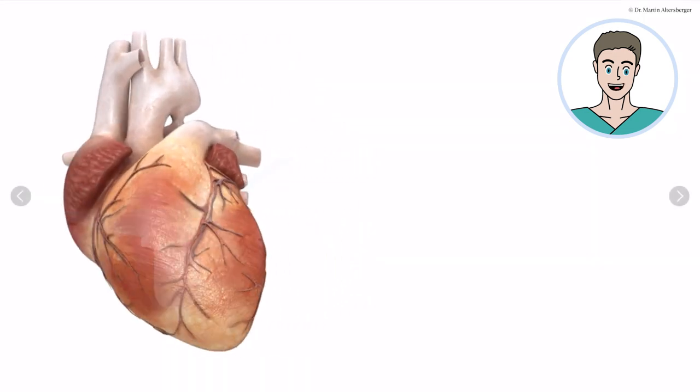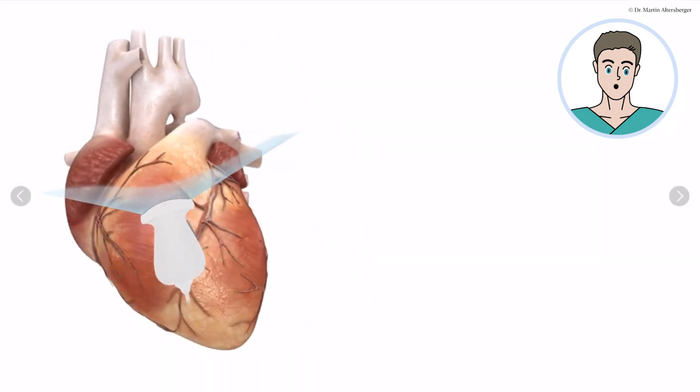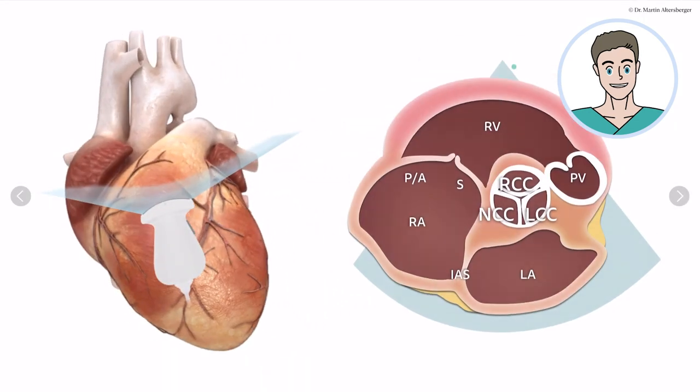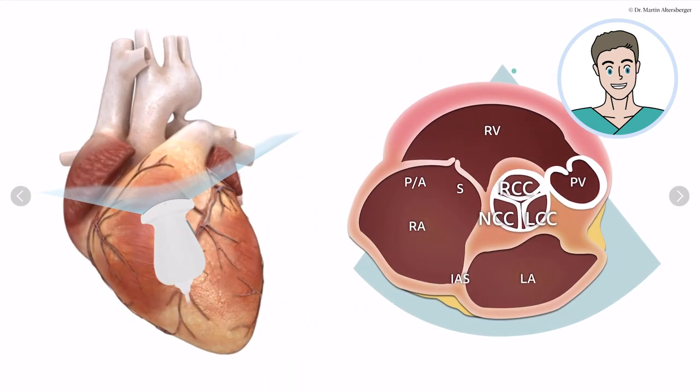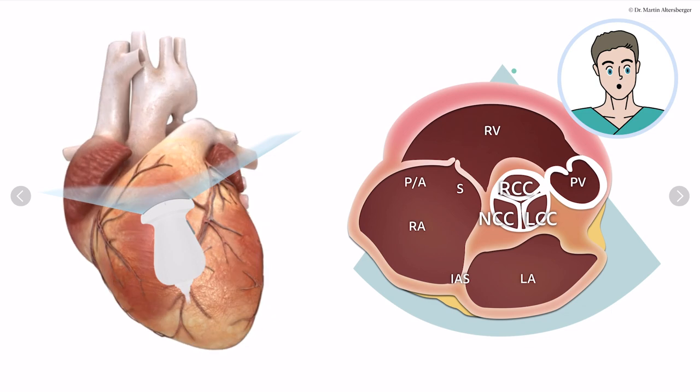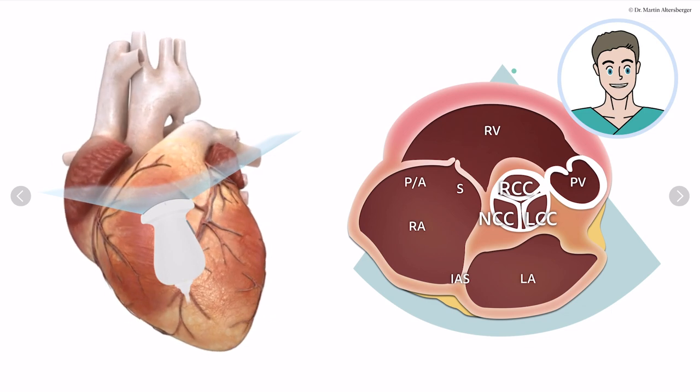How can we continue? What is the next view we need? We can move on to a parasternal short axis view.